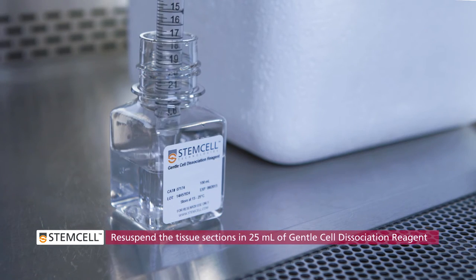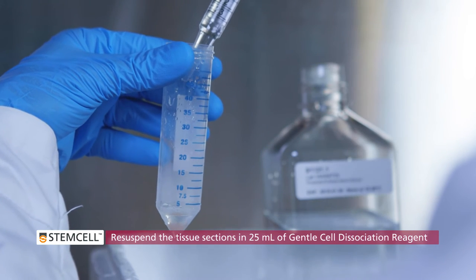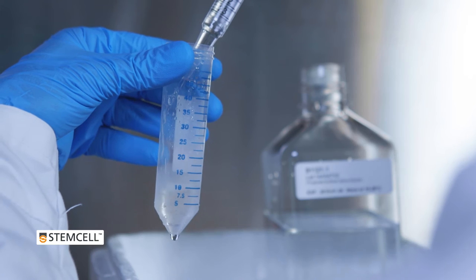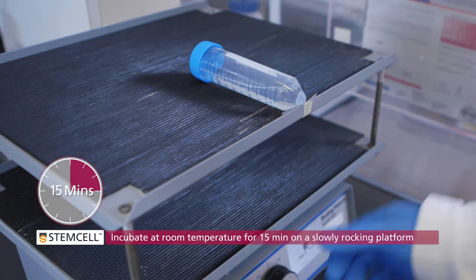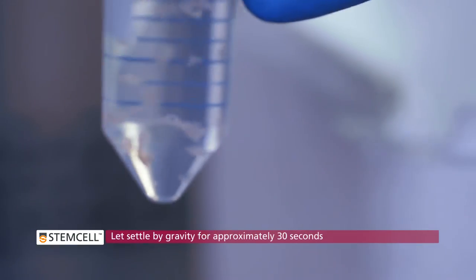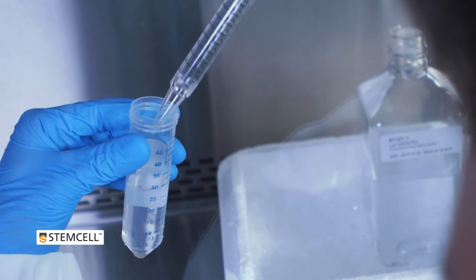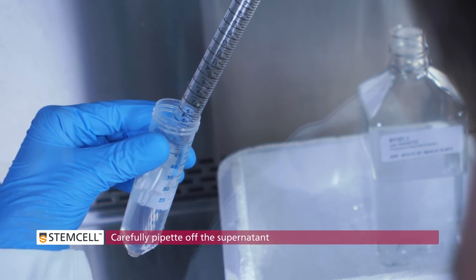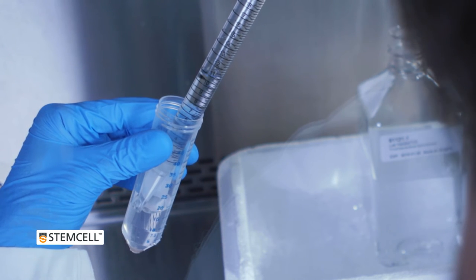Resuspend the tissue sections in 25 mL of room temperature gentle cell dissociation reagent. Incubate at room temperature for 15 minutes on a slowly rocking platform. Let the intestinal pieces settle by gravity for approximately 30 seconds before carefully pipetting off the supernatant, leaving enough to just cover the intestinal sections.